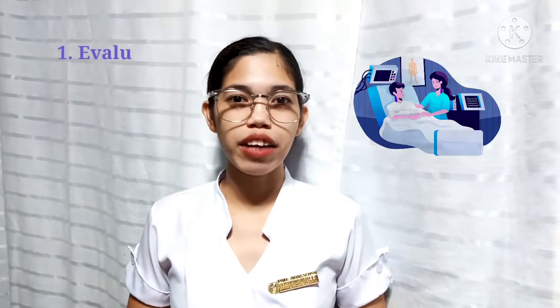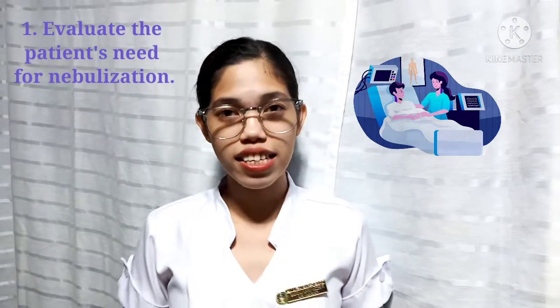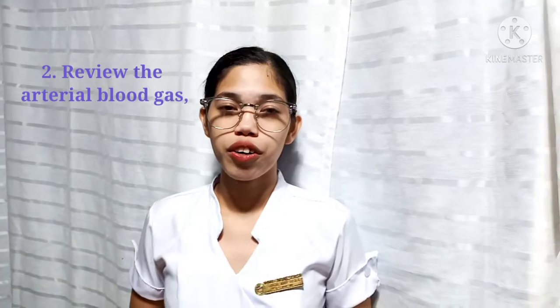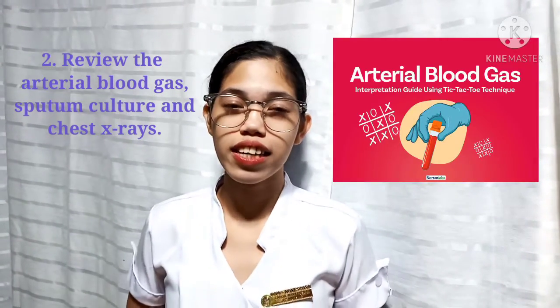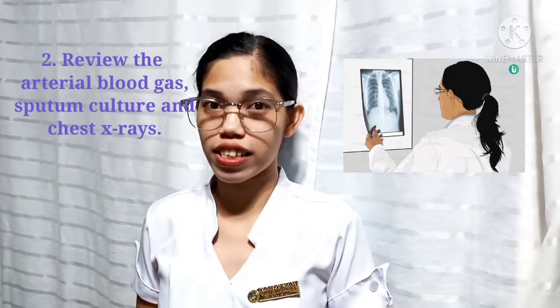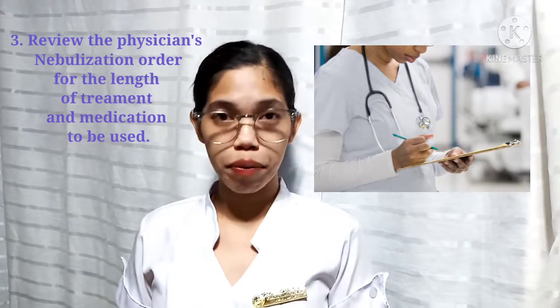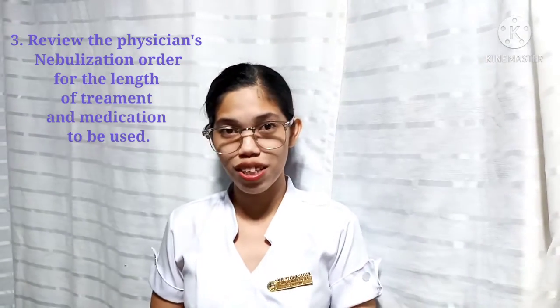For the assessment, first you have to evaluate the patient's need for nebulization. Next, you have to review or evaluate the patient's ABGs, the sputum culture, and the chest x-rays. We also have to review the physician's nebulization order for the length of treatment and the medication to be used.